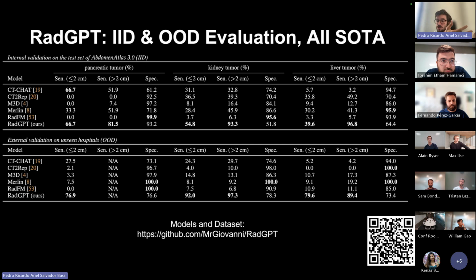So can we use segmentation to extract information and give this information to the LLM? So really a two-step approach. We think that can really create an LLM that can do many tasks that the segmentation can't, but at the same time provides the high performance of the segmentation to the LLM. So that's our current vision.